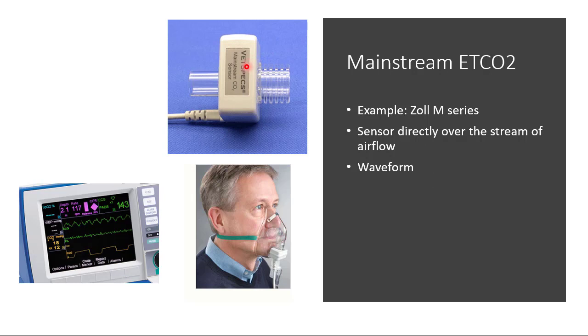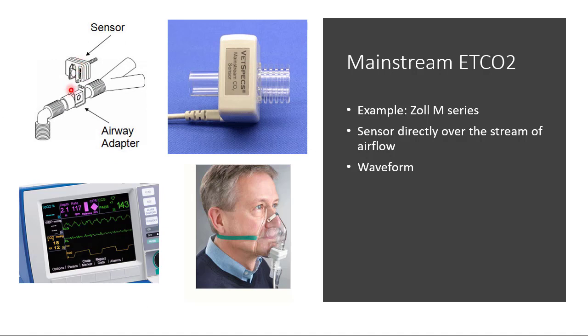You will also see this in various other forms. And often these are hooked up in the respiratory circuit. So here's a ventilatory circuit going to the ET tube, this to the vent, and it just plugs in right there. These are good in that they are almost instantaneous with each tidal volume breath, because they are measuring the airflow directly, and they aren't subject to getting contaminated by a lot of vomit in the tube because there's no direct connection. What it does is it shines infrared light through this chamber, and based on the reflection of light off different gases, it can measure End-Tidal CO2.